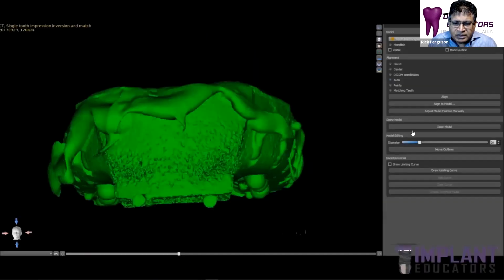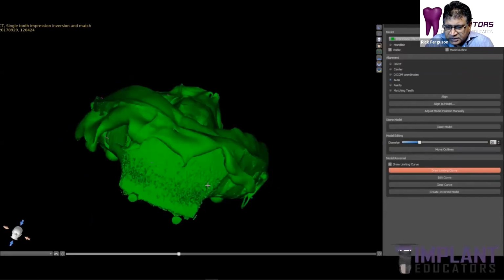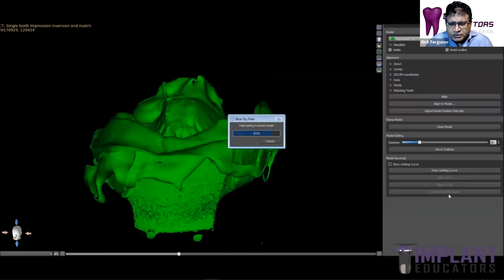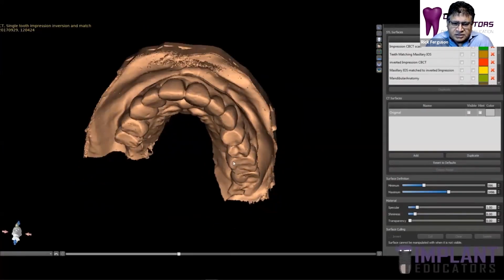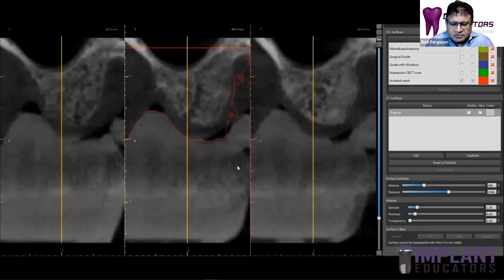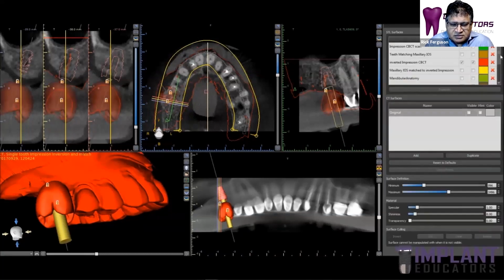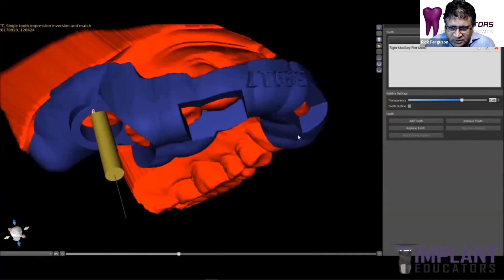Okay. Now that you have this impression, you can then use the implant planning software to invert it into a positive model. Again, this video is sped up, but it's just showing you how we're able to do this very quickly. Now we have what I call a digital pour, and this is using the same technique that I posted on YouTube several years ago, back in 2016. But you can see that it's already aligned, because we aligned the impression and then digitally poured it.